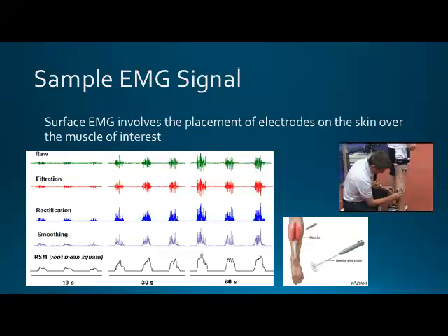If you're looking at the individual fiber properties of a specific muscle and maybe a few fiber types, like just the type 1 fibers of this particular muscle, then you might want to use something that's more precise. Usually in performance research, most people are going to utilize the surface just because you can do a wider range of activities. You're going to get similar information, just at a different scale. So this is just the more precise versus the gross measure. Yeah.